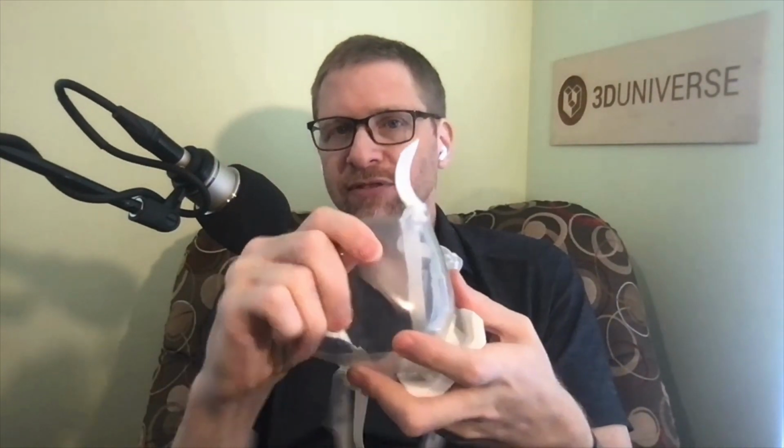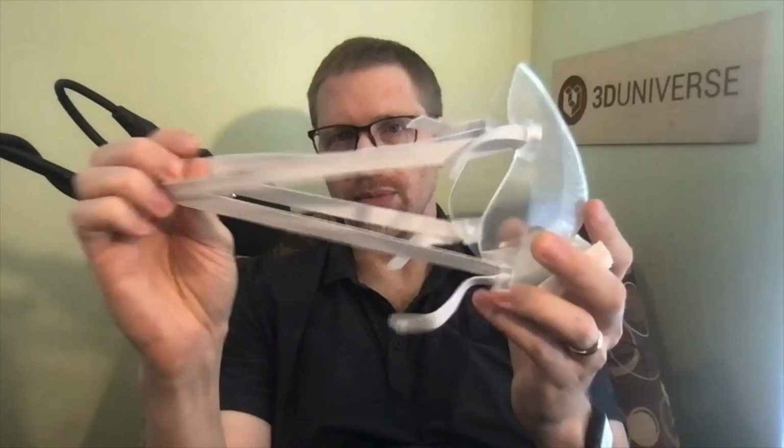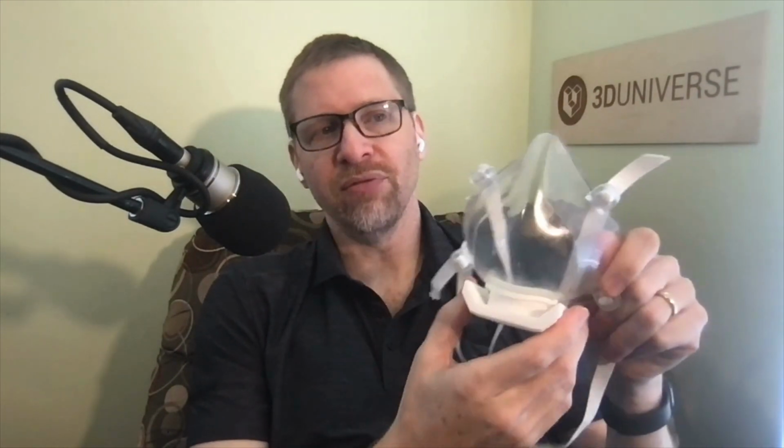So this mask is injection molded using a soft and clear material that is very comfortable to wear, again assembled with a couple of straps. And as you can see here, we used a 3D printed cartridge for the filter, but it's positioned down under the chin, so that when you're wearing this mask, the filtration is happening down here so that it doesn't block your face, and you have a clear view of the face. So that's the Harbeck mask, and that's the second design that we came up with.